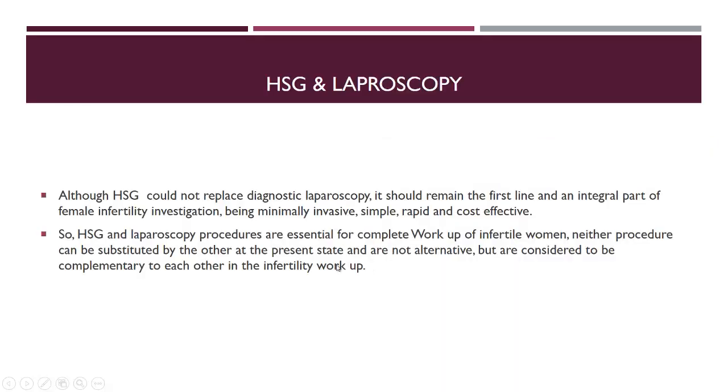So hysterosalpingography and laparoscopy are complementary to each other and not competitive. Hysterosalpingography cannot replace diagnostic laparoscopy, but it is the first line and an integral part of the female infertility investigation. It is usually minimally invasive, rapid, and cost-effective. So they complete each other, and the gold standard is the laparoscopy, of course.